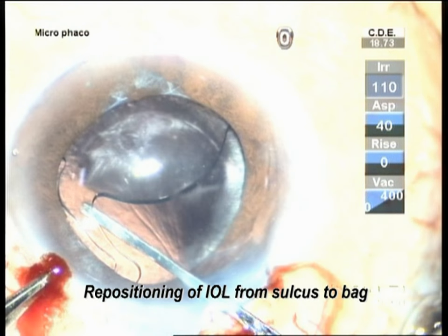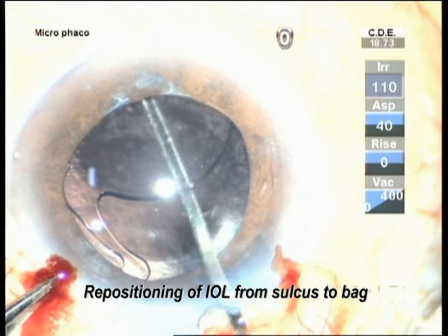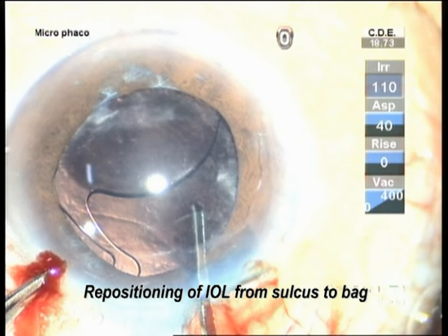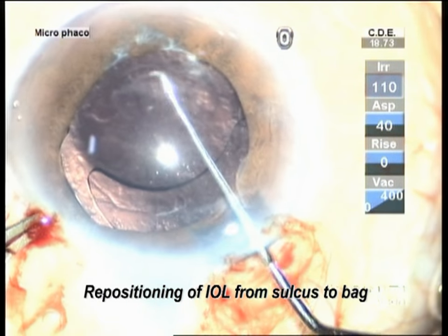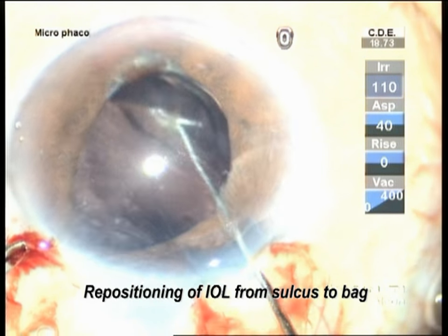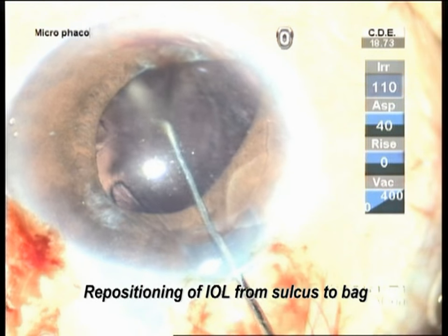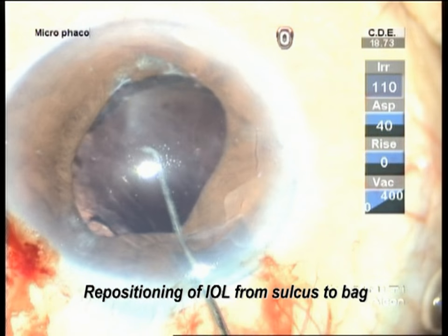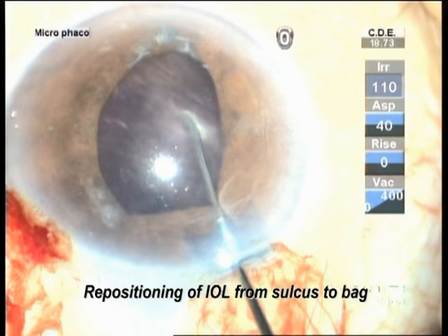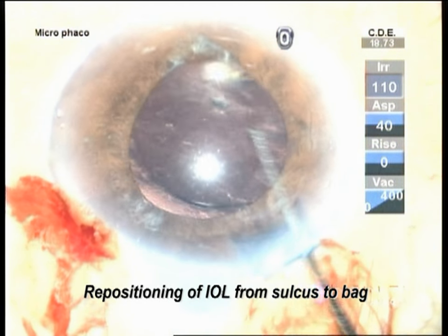This is a simple case of a hydrophilic lens with both haptics curved in the sulcus, that's why the lens was sulcus-fixated. With the spatula, the bag was made open, the capsule was polished, and the lens was slid into the bag. The advantage of hydrophilic lenses is that with pressure they easily slide into the bag. It's very simple.